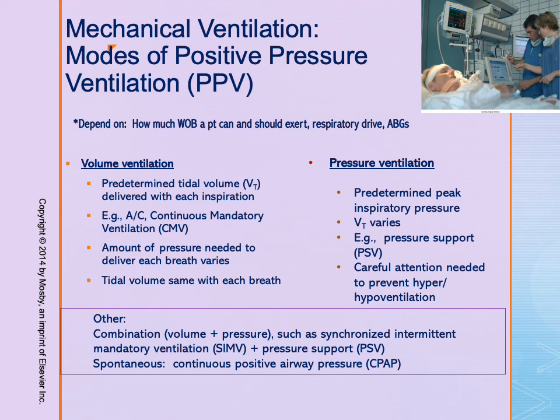This mode of ventilation is often used in weaning the patient off of the ventilator or as a supplement to other modes. The patient controls the rate, so the patient will control when they breathe, and they also control the tidal volume. So it's important to monitor the pressure for hypo or hyperventilation.